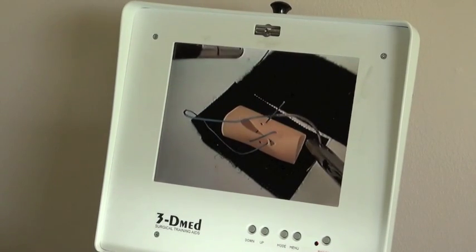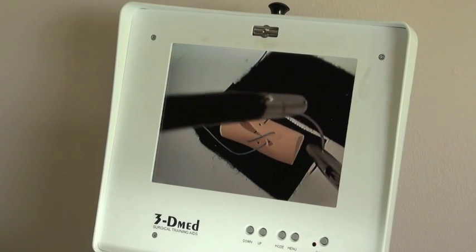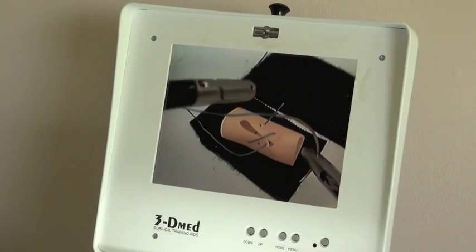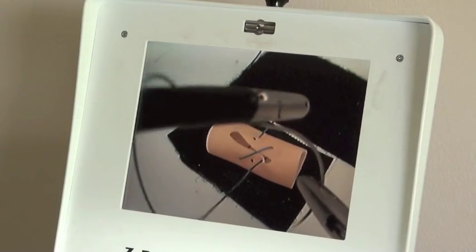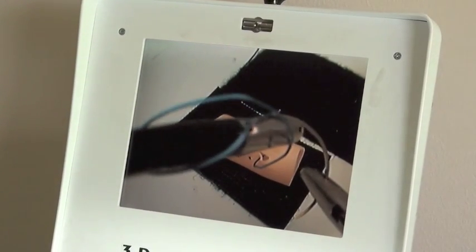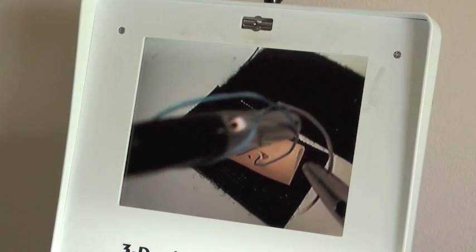Now just like the vaginal cuff is a horizontal line, I want this. The stiffest part of the area is between the needle and the suture. And then I'm going to do a wrap. One. Small movements around the stiff part of the needle. Two.